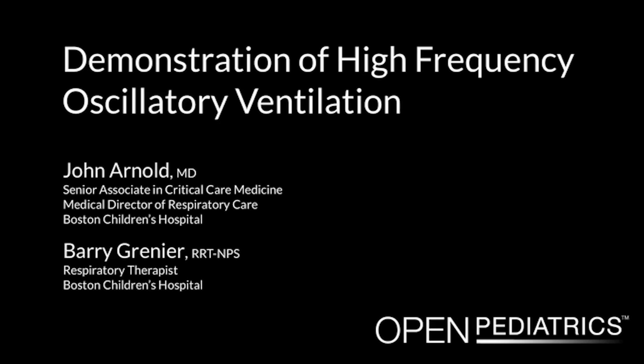Demonstration of high-frequency oscillatory ventilation by Dr. John Arnold and Barry Grenier. Please note that in this video we will be following the guidelines used at Boston Children's Hospital. Some of this information may need to be modified based on the equipment, guidelines, and practices in place in your institution.